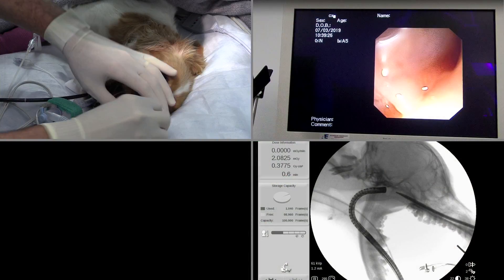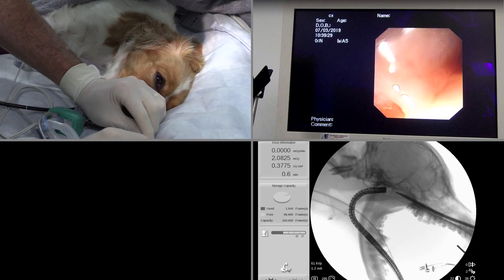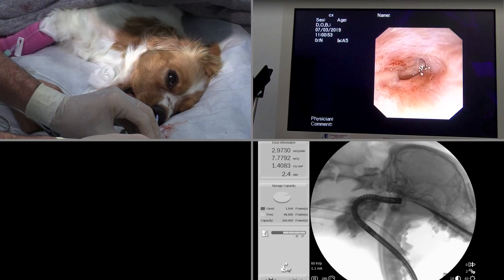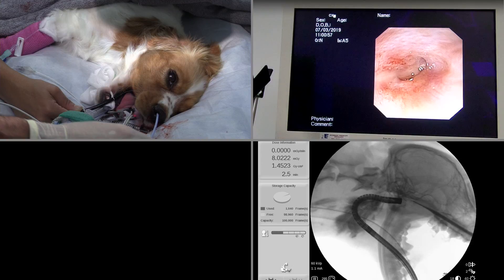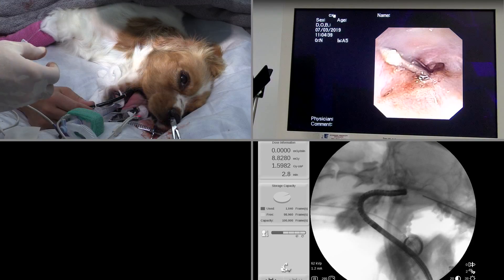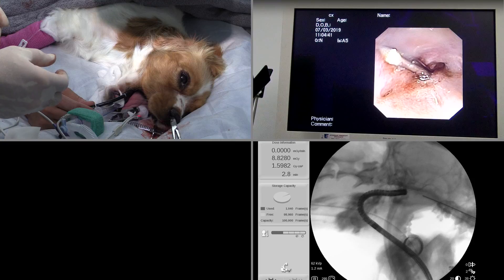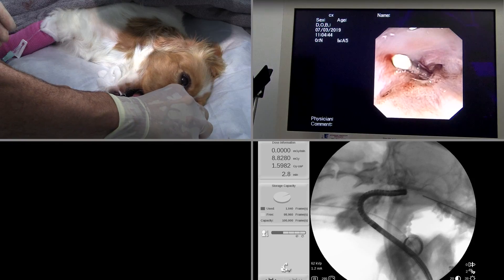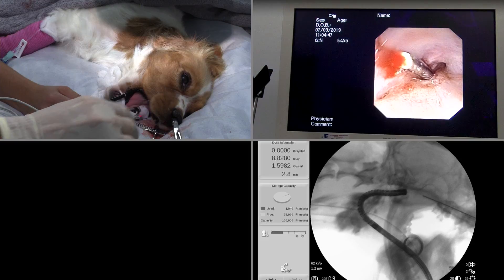Here we have the patient in lateral recumbency and we're attempting to pass a catheter through the stenosis, but it turns out that the stenosis was completely imperforate and more like an atresia. Here we were finally able to pass an IM pin through the stenosis, and then we were able to pass a catheter over the intramedullary pin.